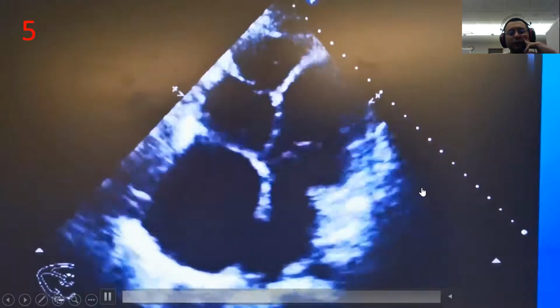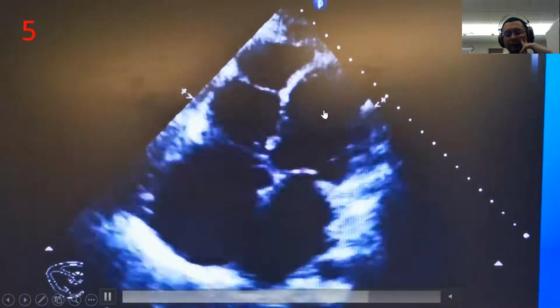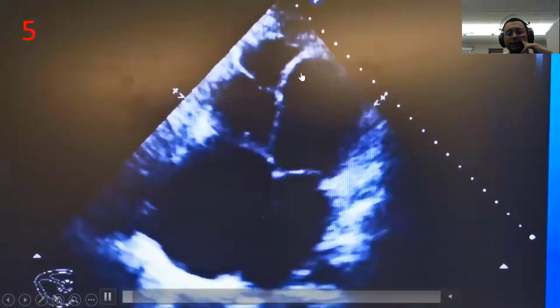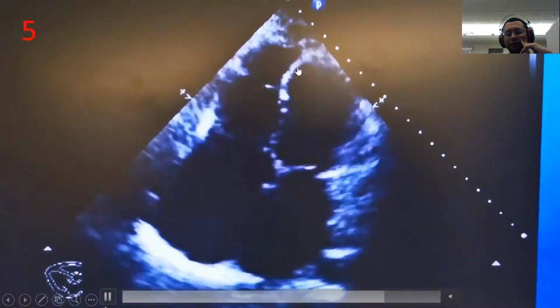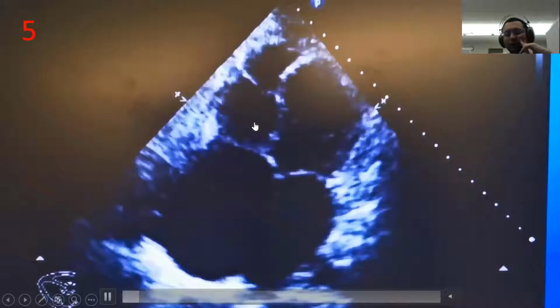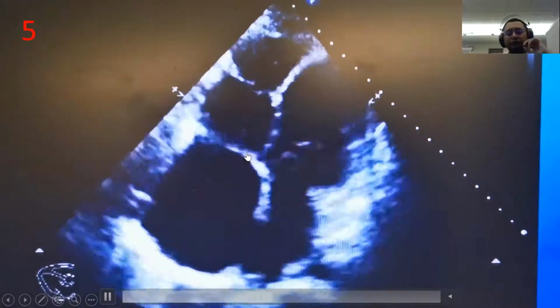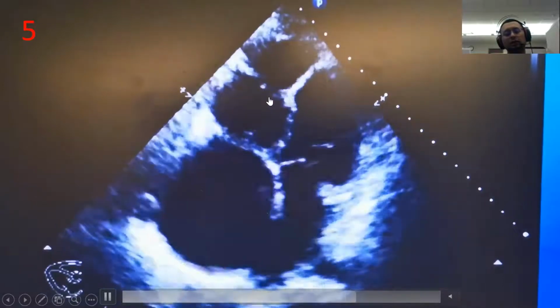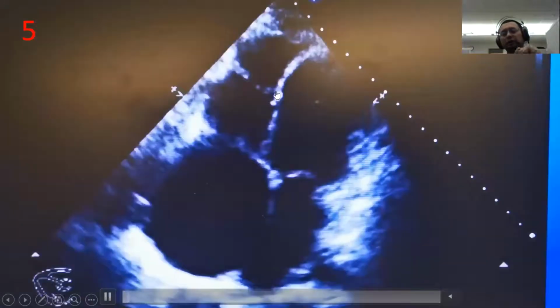All right. So this is an apical four-chamber view. Okay, so that is LA, RA. So LV, there's RV there. Okay. So how do I know that this is the right ventricle, Saravan? Trabeculations. Yes, the right ventricle has coarse trabeculation. Some more, just looking at this echo. Insertion of the tricuspid valve. Very good. So the insertion of the tricuspid valve is apical to the insertion of the mitral valve. So that's one. Then what is number two? What is this? The moderator band there, right? That's the moderator band. The moderator band is a structure of the right ventricle. That's why we know that this is the right ventricle.